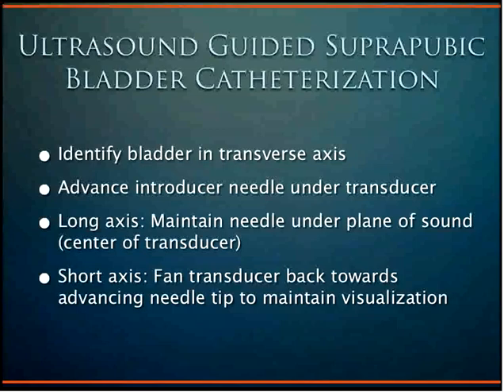The introducer needle is advanced under the transducer. If the approach is to place the needle under the long axis of the transducer, then the needle must be under the exact center of the probe at all times, otherwise it will be out of the plane of the sound and will not be visualized.